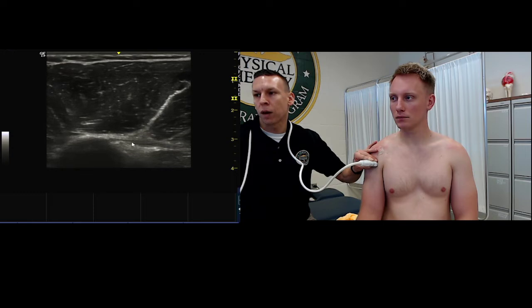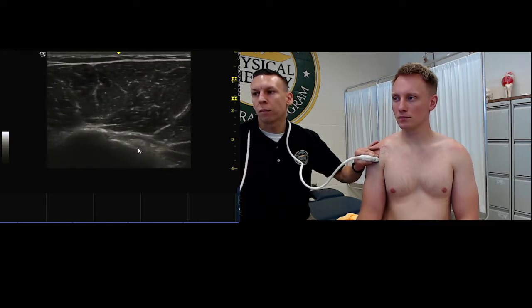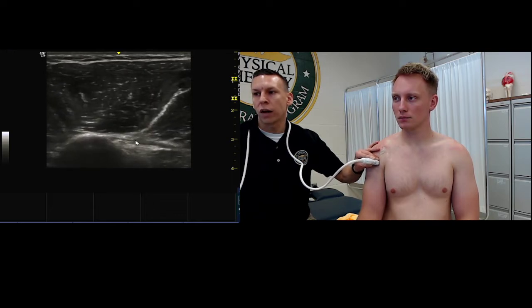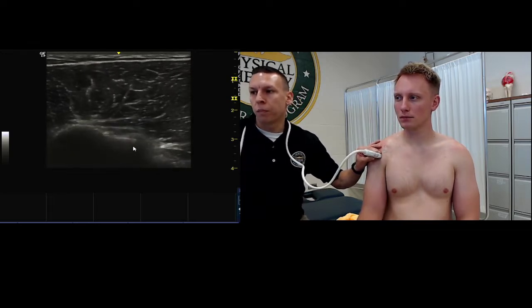It's going to come right here, right over top. So there's part of the pec tendon right underneath the bicep. You could continue to visualize the bicep, but usually I like to go down at least far enough to visualize this pec tendon. So if you're looking for any pec tears, you can do that there.